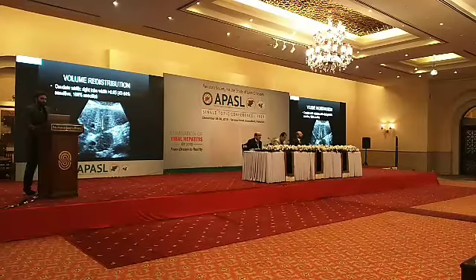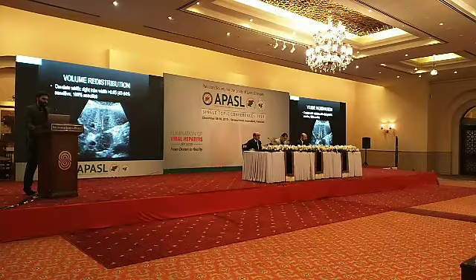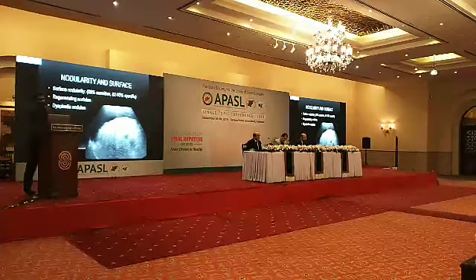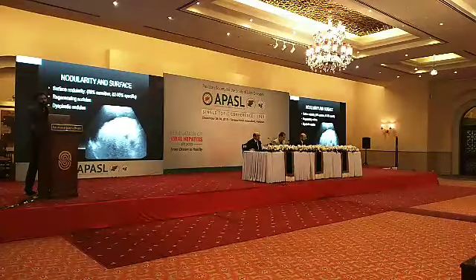Size increase. One is the caudate width to the right lobe width ratio, and this is pretty specific. Now, nodularity: it is very important for the sonologist, the radiologist, to see the surface of the liver.